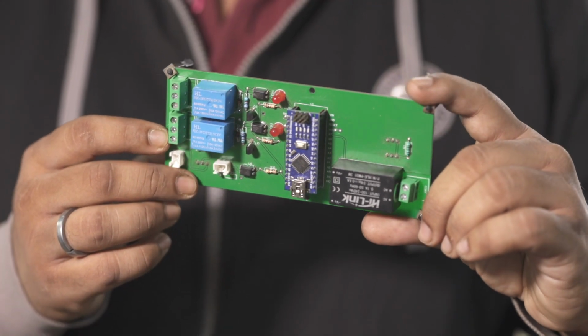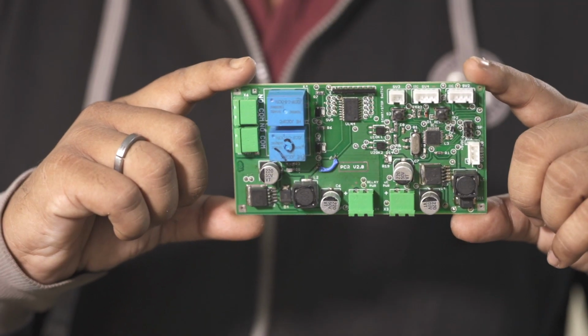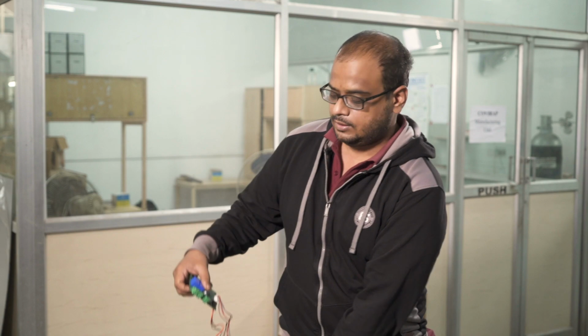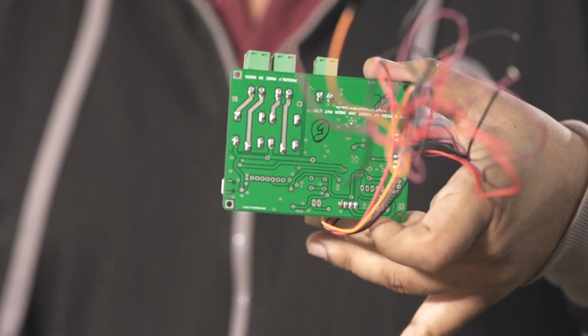The first version of the PCB was quite crude, after which we did several tests and identified ways to make the PCB further smaller. This was the second generation PCB that we've developed, after which we started working with SMD components, which results in smaller PCBs and finally culminating in the PCB that we've been using in the present device, which is the size of a credit card.